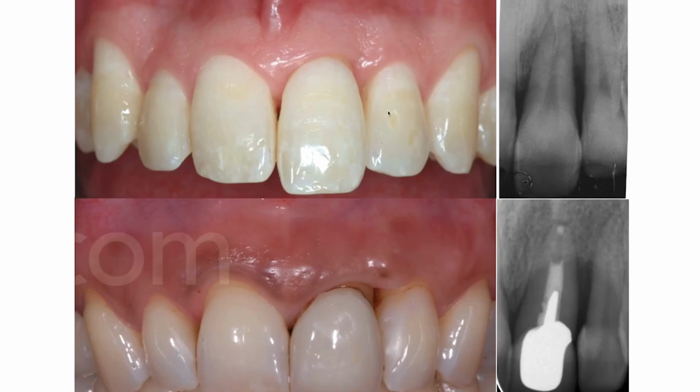So it is the presence of some tissue, even if small, even if thin, but that can be managed surgically, that is the key point for maintaining or extracting a tooth, even if radiographically this bone defect is more or less the same. And the distance between the roots is more or less the same. I can tell you that most probably this root is even closer than this, but here there is no soft tissue between the roots. So there is no way to achieve periodontal regeneration.